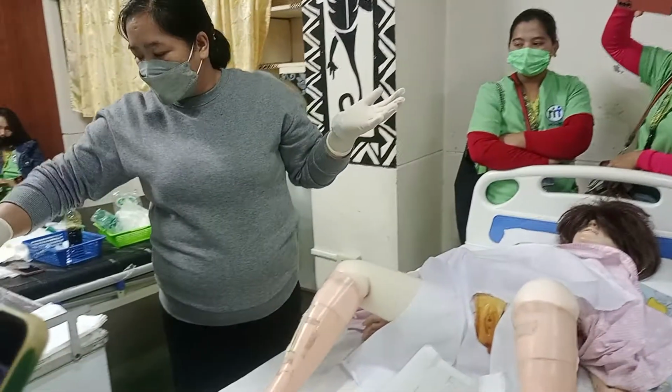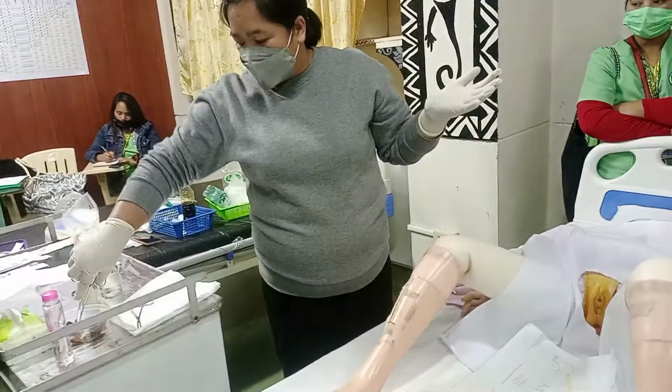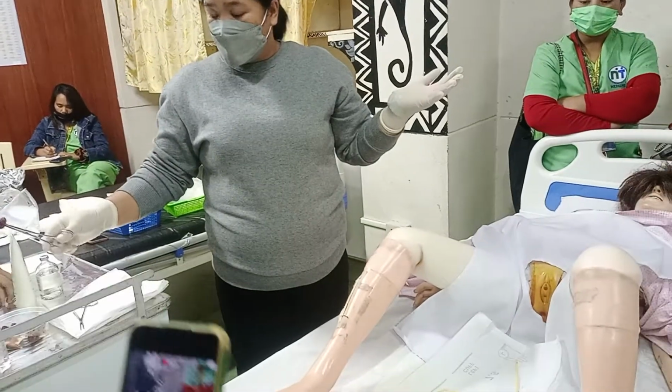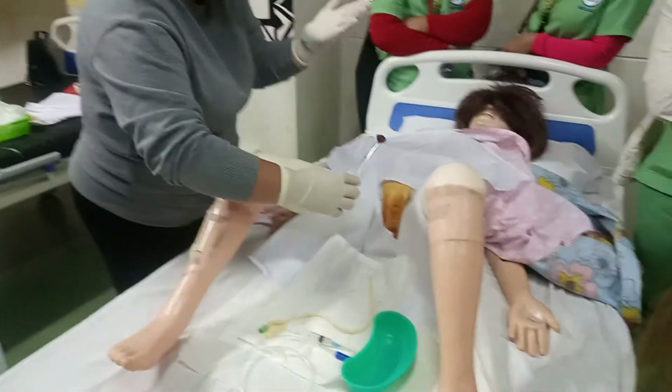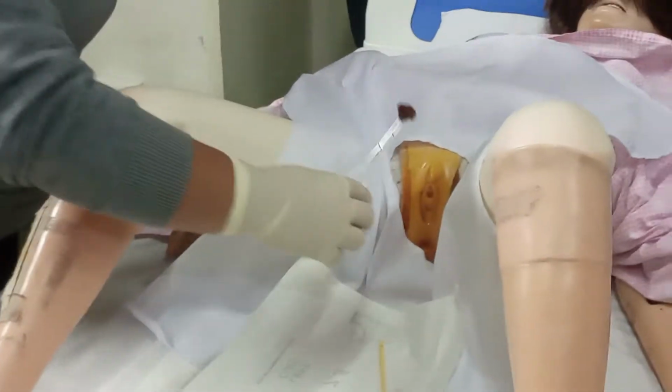So, I will now, sterile na ako, di ba? I will now start with the procedure. Okay? So, I will get 1 cotton ball with betadine and I will wipe. Laging nakataas yung kamay ninyo. Huwag niyong igaganon kapag naka-sterile na kayo.